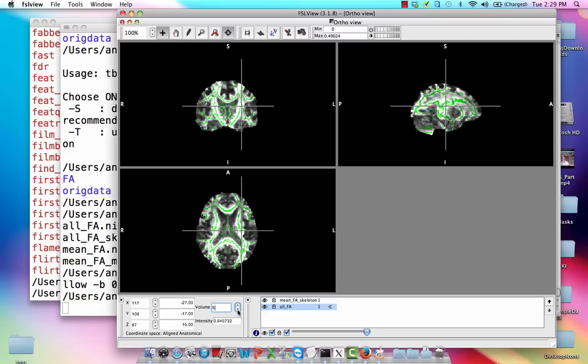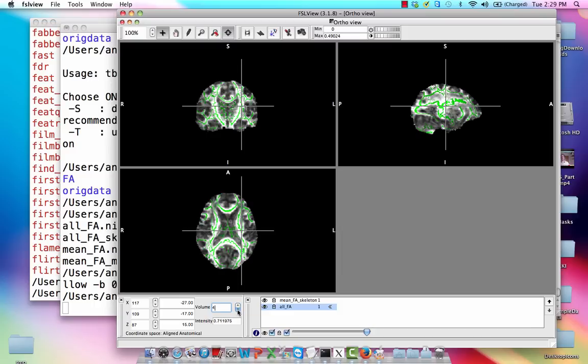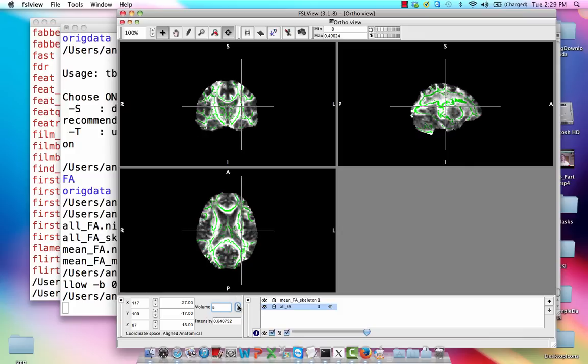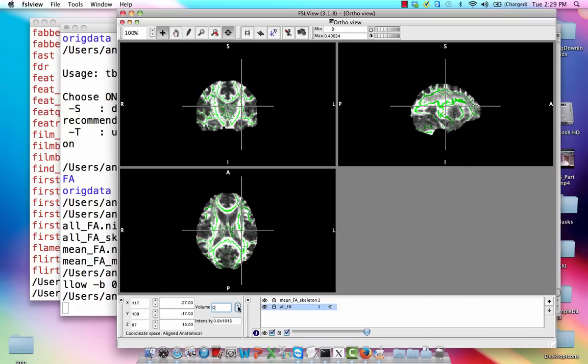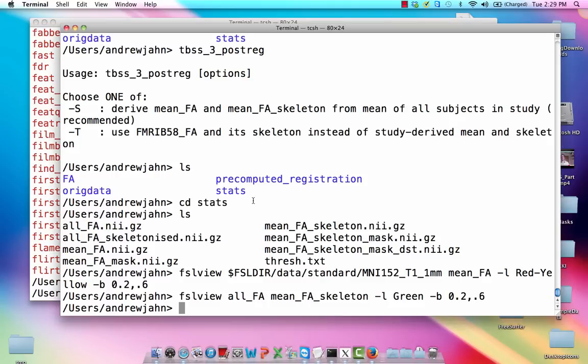And it seems to do a pretty good job. So we're just making sure that it's going to be a good candidate for doing a group level analysis, that it's actually going to be looking at white matter and not something else.